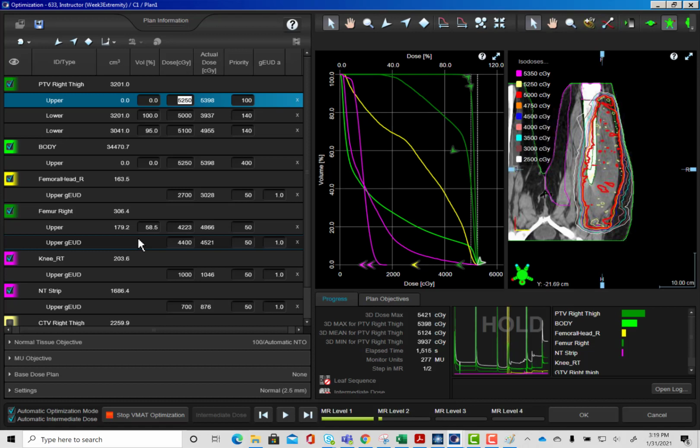Okay, so in this class, I really want you, at least in these first few weeks, to pretty much do things exactly like I'm doing, just to experience it. But what you'll end up doing is slowly over time, you'll pick different pieces of what other people are doing, different pieces that you like, and develop your own optimization method, okay? But for now, I want you to try these steps out that I'm doing and see what you think. Obviously, I think it's the best way because it's how I do it, okay?